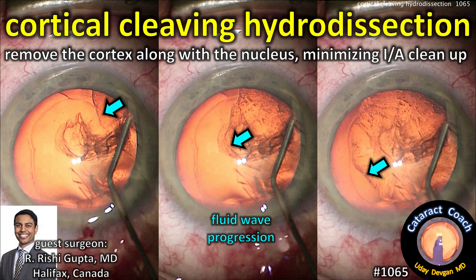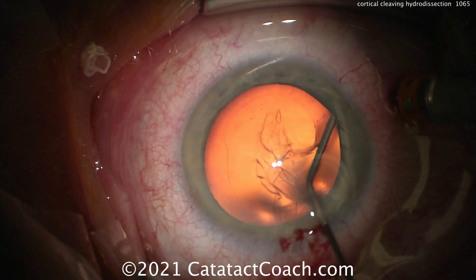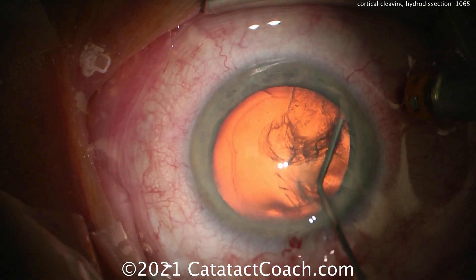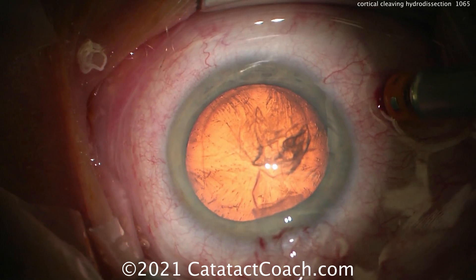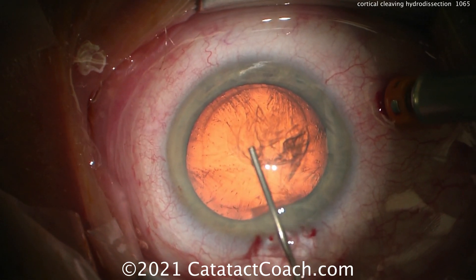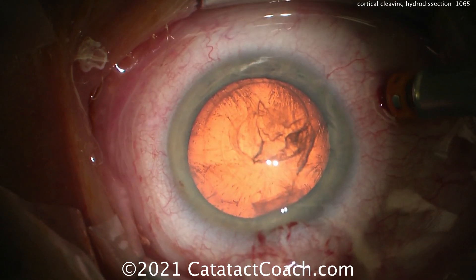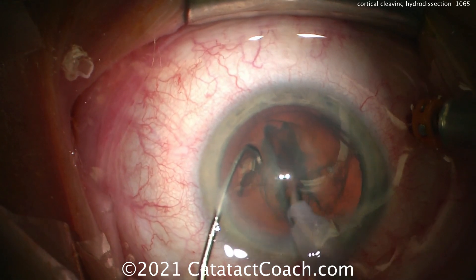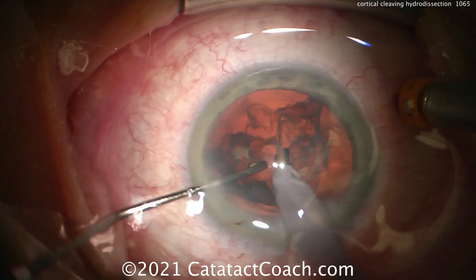Cataractcoach.com presents cortical cleaving hydrodissection. Our guest surgeon is Dr. Rishi Gupta from Halifax, Canada. This is a technique where — watch carefully — a fluid wave goes between the capsule and the cortex. The cortex stays adherent to the nucleus, but the cortex is separated off of the capsule, so now the nucleus can be removed using whatever technique you wish — here it looks like a stop and chop technique.